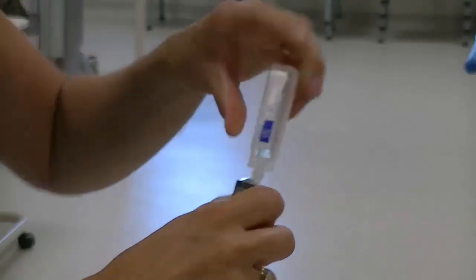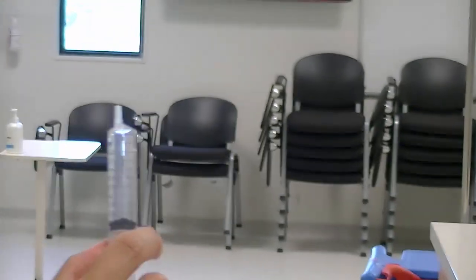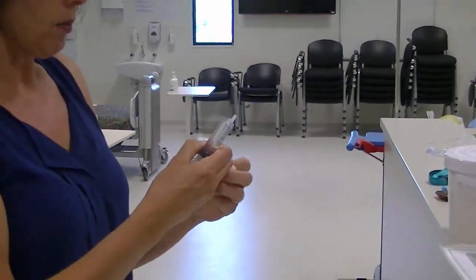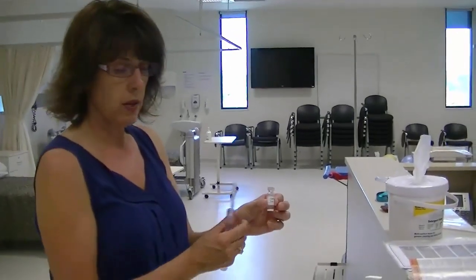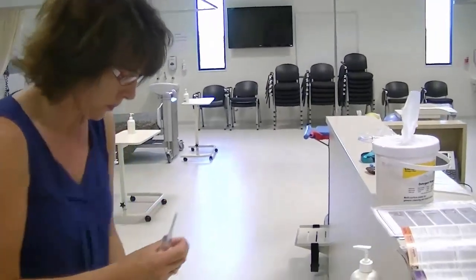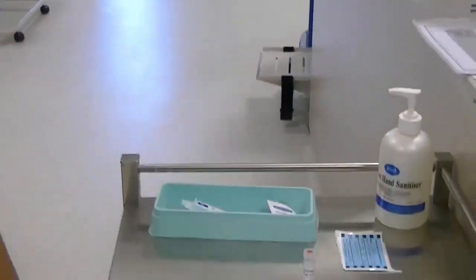So I'll draw up the water first. It said 10 ml of water for injection. We just want to make sure we dissolve and dilute the drug down. Now as this is going into a burette, the air bubbles do not matter as much because there's air in the burette. This needle has to pierce through the top of the rubber stopper of the drug, so I need a sharp needle. I will swab the top of the drug, wait for 30 seconds.